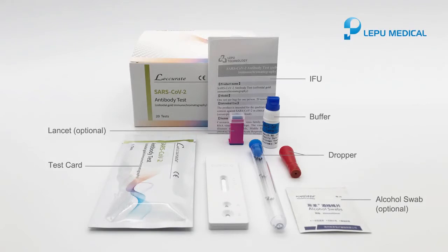Take one test cart, one dropper, and a bottle of buffer from the box. Prepare one alcohol swab and one lancet.